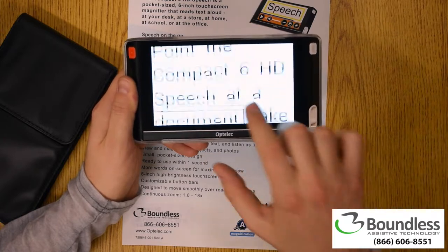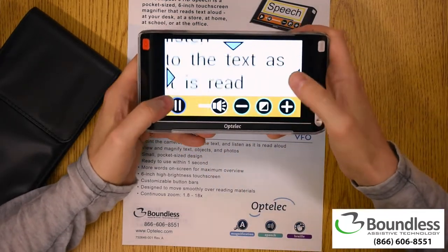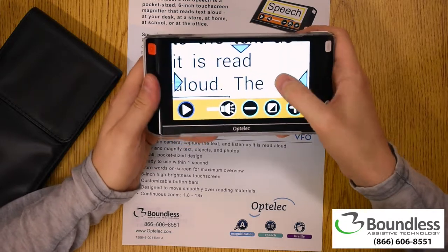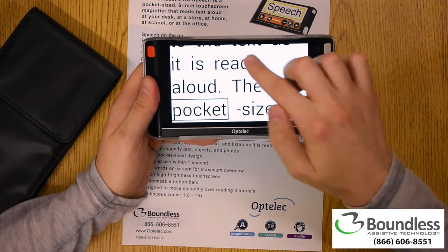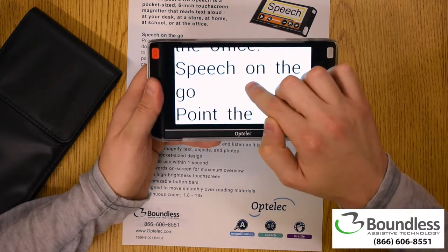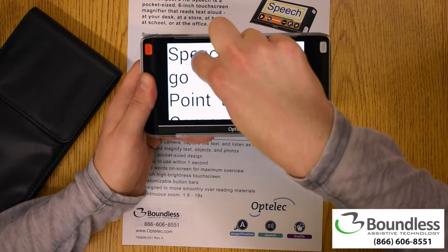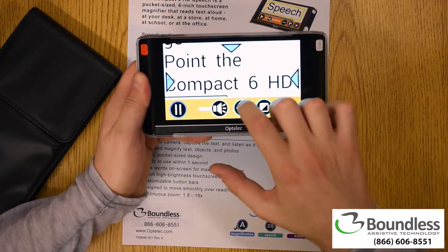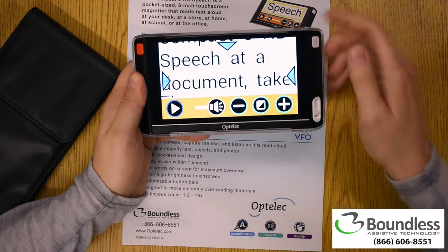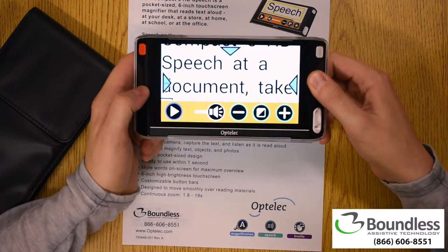Maybe I start reading and decide I need to pause it — I can go ahead and click pause. Maybe I heard something I want to go back to — I can move back to it. Then when I want to start reading from that point again, easy as a finger press and hold, and it's going to start reading from that point. I can also plug in headphones with this device, or connect it to a Bluetooth speaker or Bluetooth headphones.